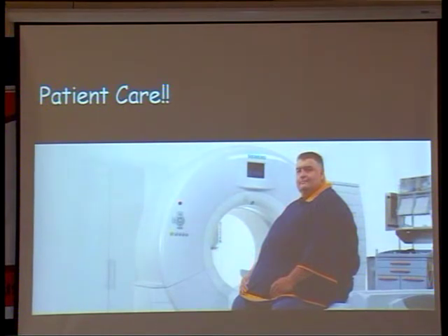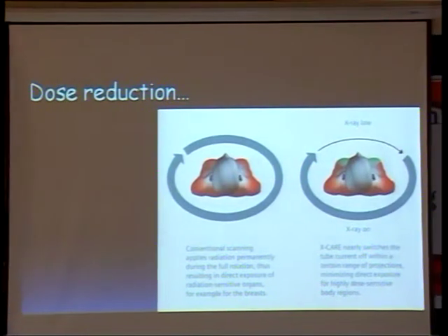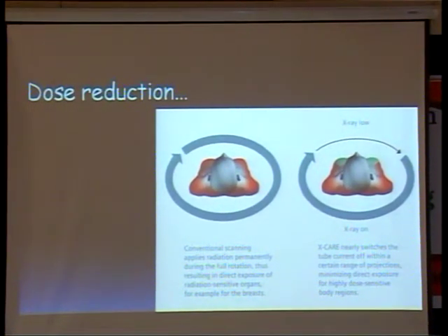This is a new advancement in the field of CT. Plus dose reduction. Dose is a very, very important thing when we talk about developed nations like the US and Europe. Dose plays a huge role there, and companies run or shut down because of dose issues.